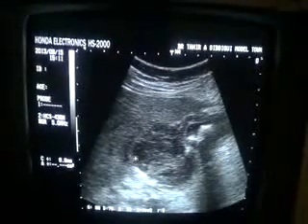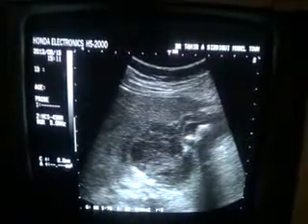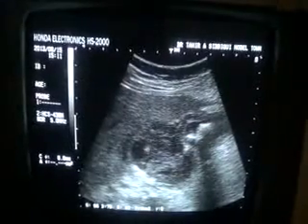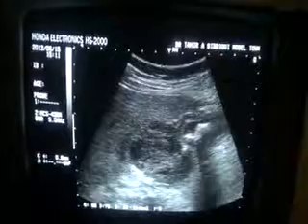And one of the indications that this is in fact a cystic mass is that you can see the posterior wall acoustic enhancement and cystic areas. A few tiny echogenic particles are seen within it, and this relates.